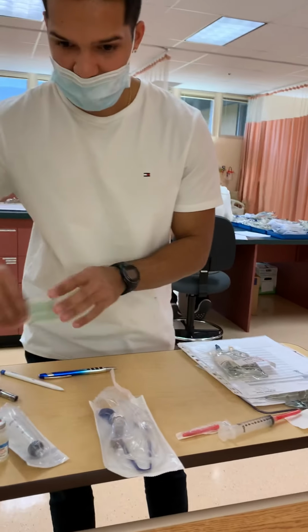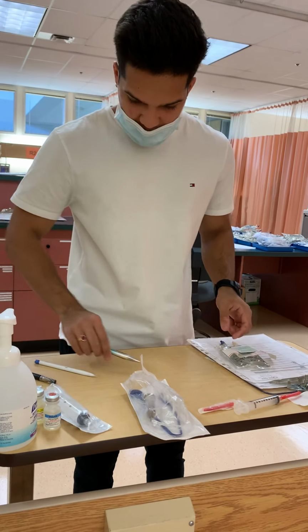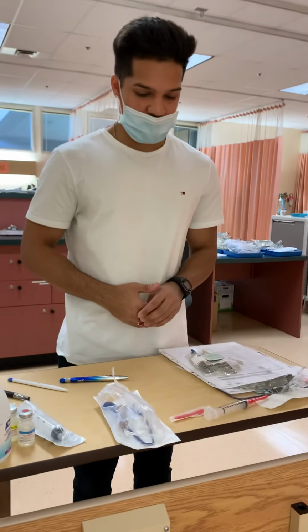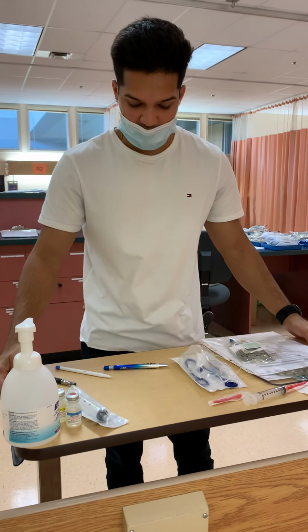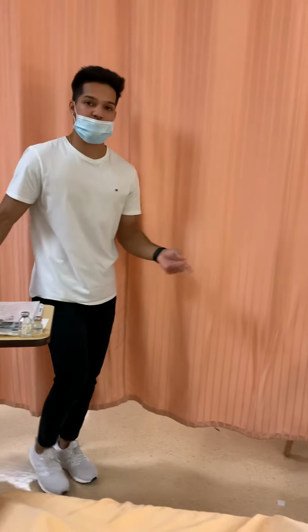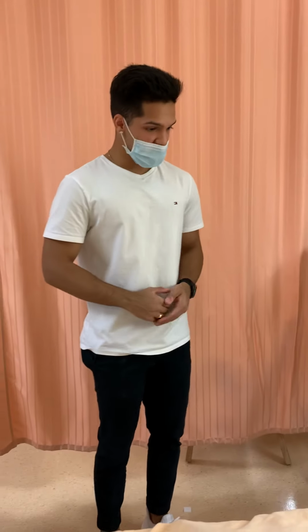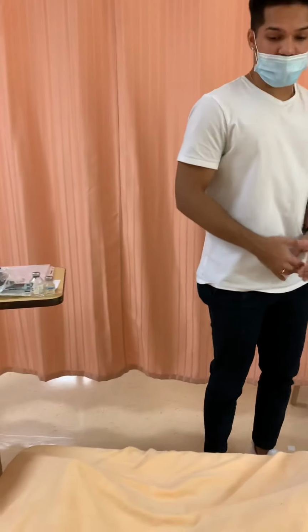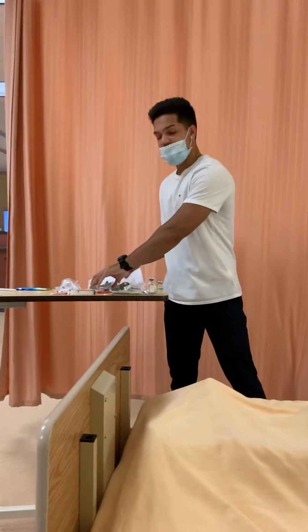I'm just going to be taking an alcohol swab, and my pen and my MAR to the patient's room, and my secondary tubing, which I know is not damaged, it's good to use. Okay, so now I'll be heading over to the patient's room, and upon entering the patient's room, I'll also do my entry safety check, making sure call bell is in reach, patient is not in distress, there's no tripping hazards, and the bed is at the lowest position possible. Once I've done that, I can do hand hygiene, and then I can introduce myself to the patient.